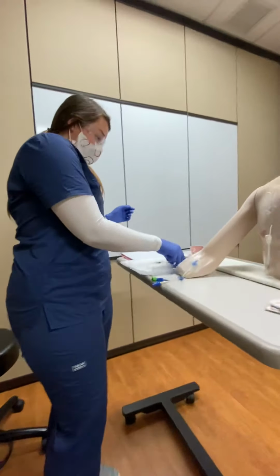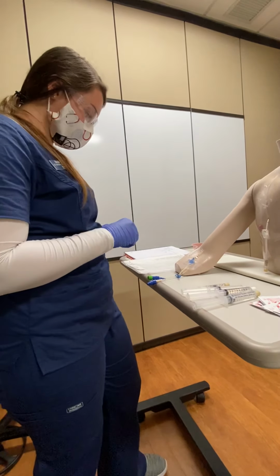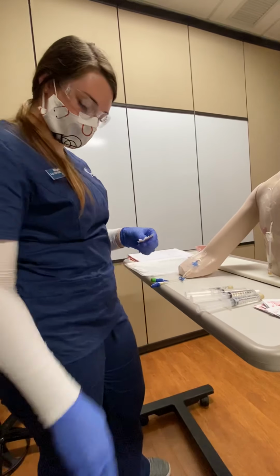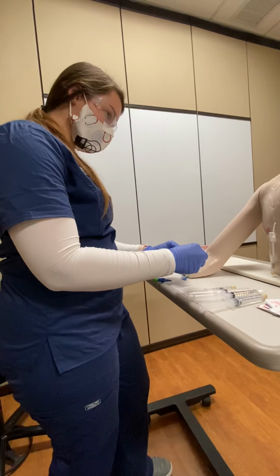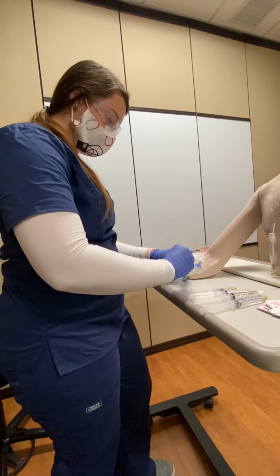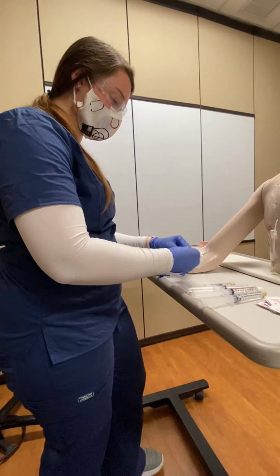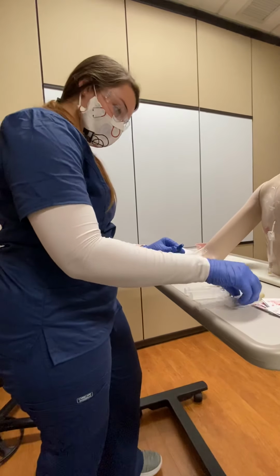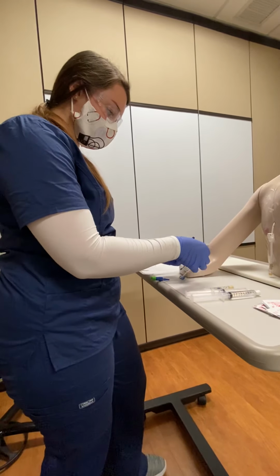All right, so what I'm going to do first is move this stuff over here. I have on my gloves. I'm going to clean the site. Do you have any questions before we start? No? Okay. All right, so I'm going to clean this for 15 to 20 seconds, or per the policy of the facility. Okay. Take off the cap without contaminating.